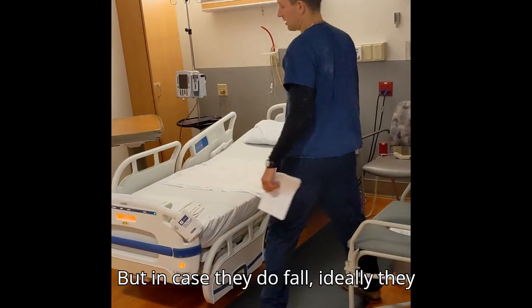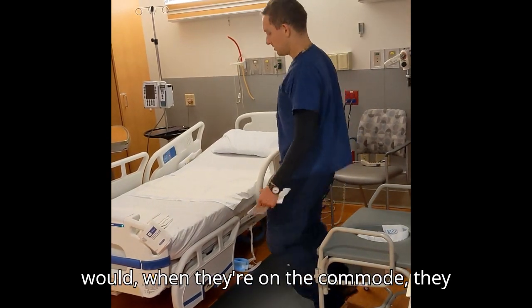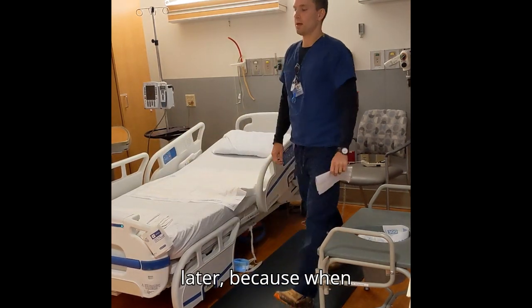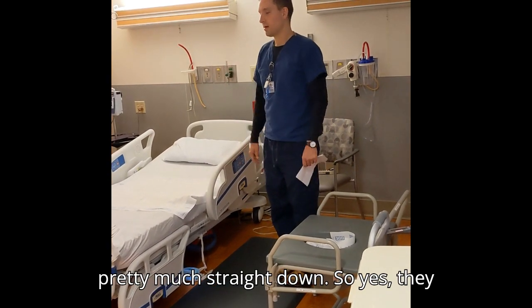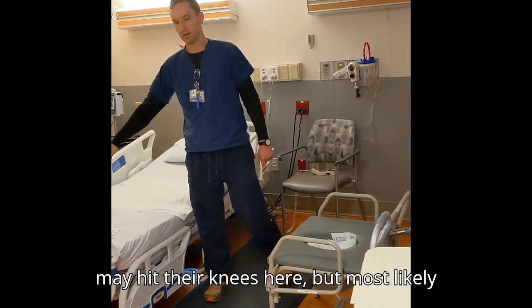But in case they do fall while they're on the commode, ideally they would fall into the bed, as you'll see later. Because when patients usually fall, they're falling pretty much straight down. So yes, they might hit their knees here, but most likely their head's going to be fine.